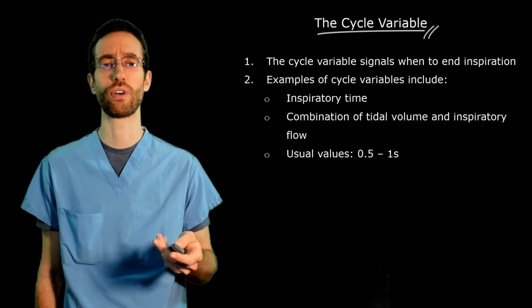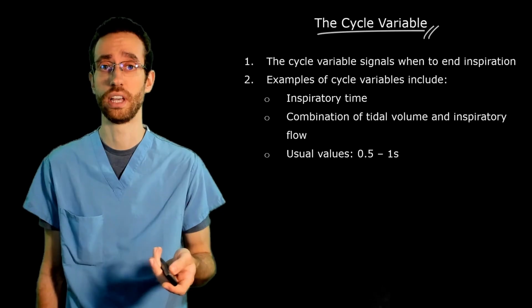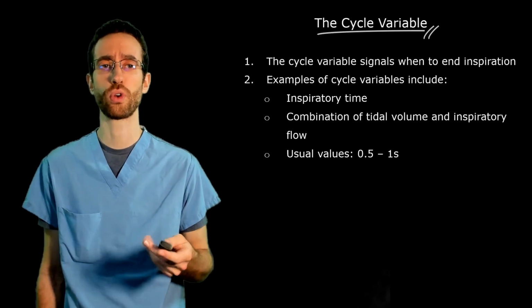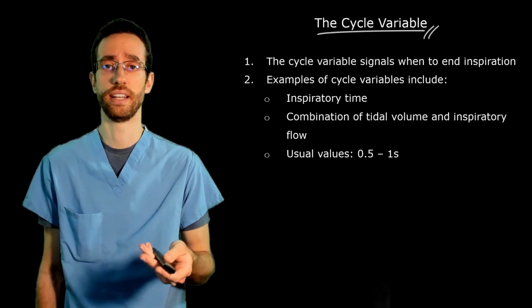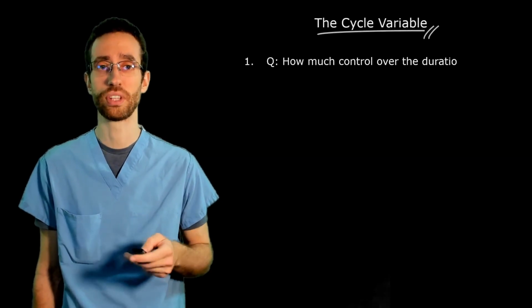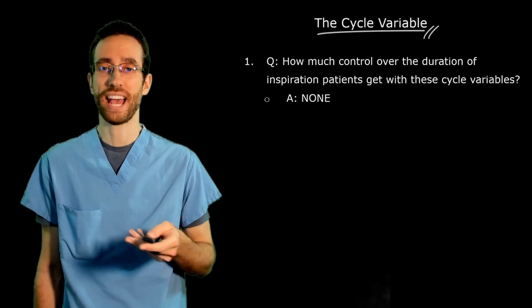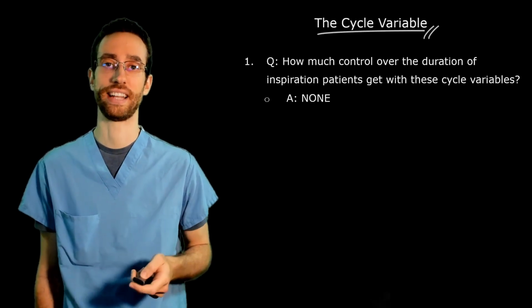Do you control for how long you inhale? Although unconsciously, the answer is yes. Your central nervous system controls every aspect of your breathing, taking several factors in consideration. Think now of the cycle variables that we talked about. The patient really has no control over their I time.